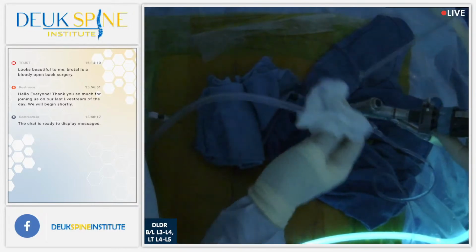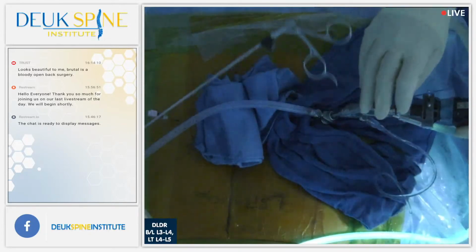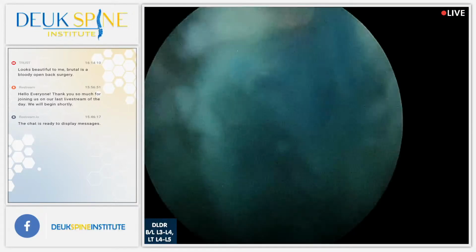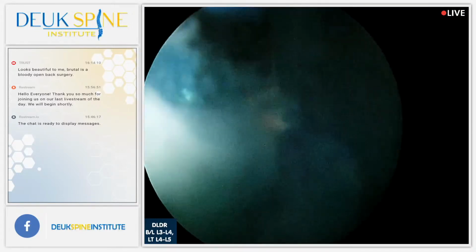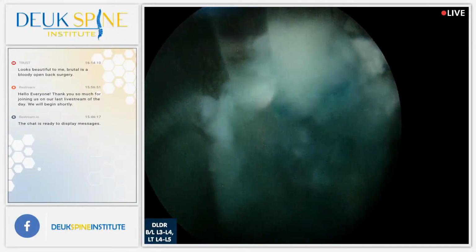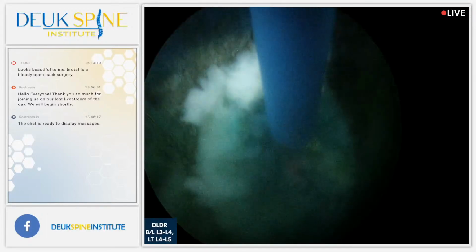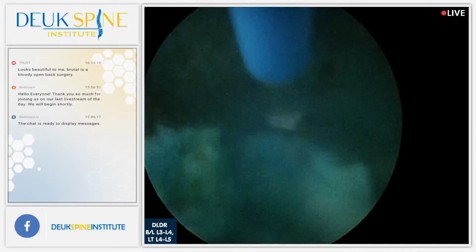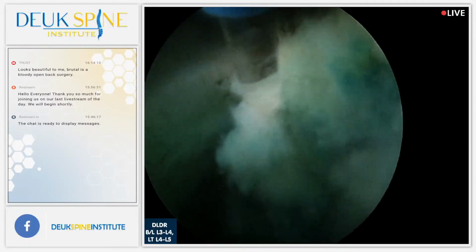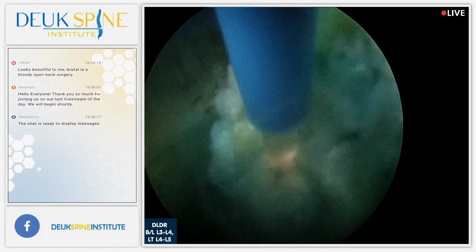I can feel the needle in there. I was grabbing at it. Remember, there is a needle in here because there's one coming from the other side, since we're doing bilateral. So you're going to see it in a minute. And the thing about it is if I actually hit it with the laser, I'll melt the steel together. And then Luis will curse me under his breath for the rest of the day. Or maybe out loud, because it gets very hard to open and close it. Open and close the other one just a little bit so we can make sure it's okay.